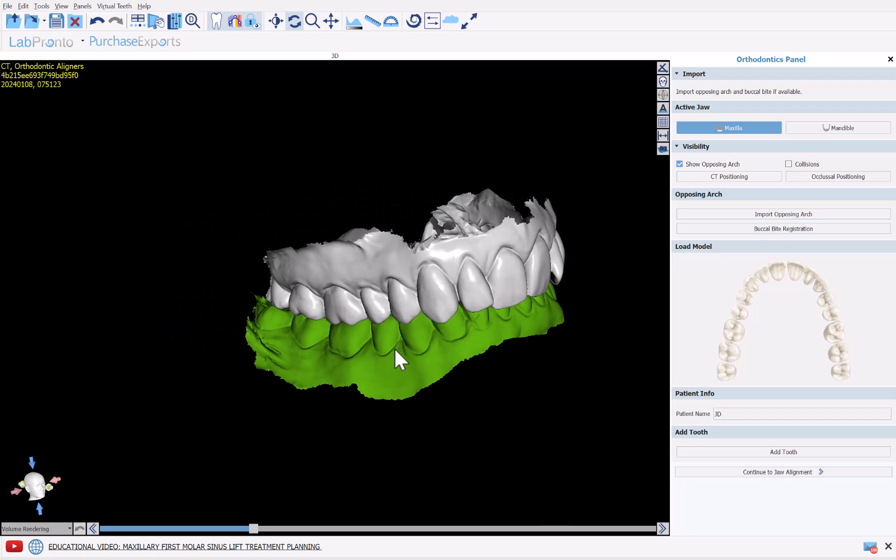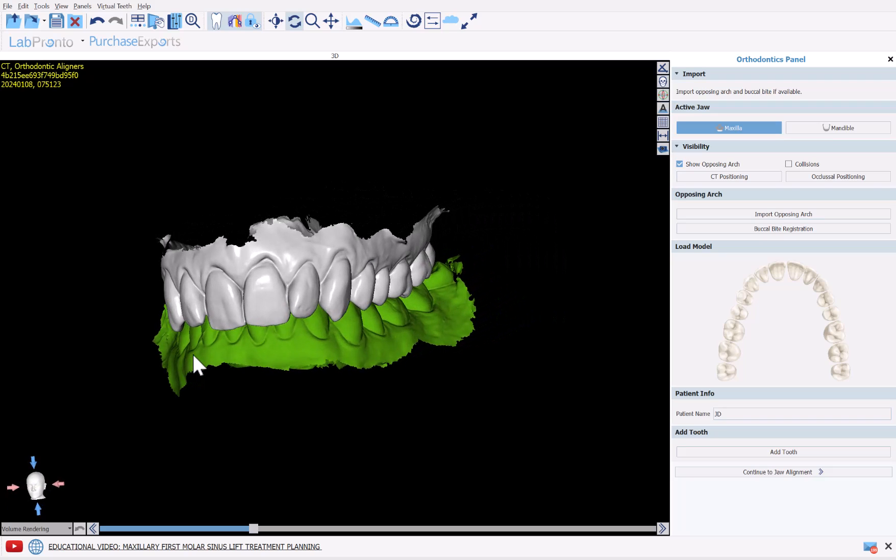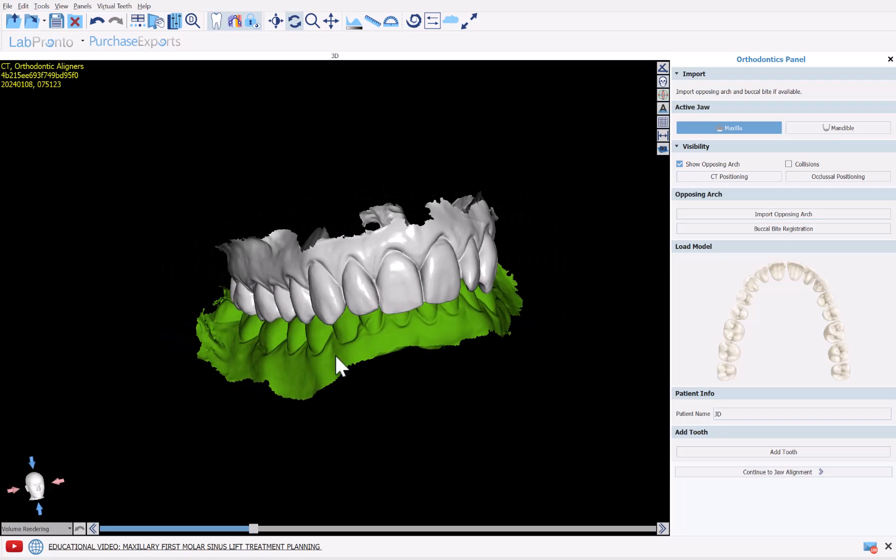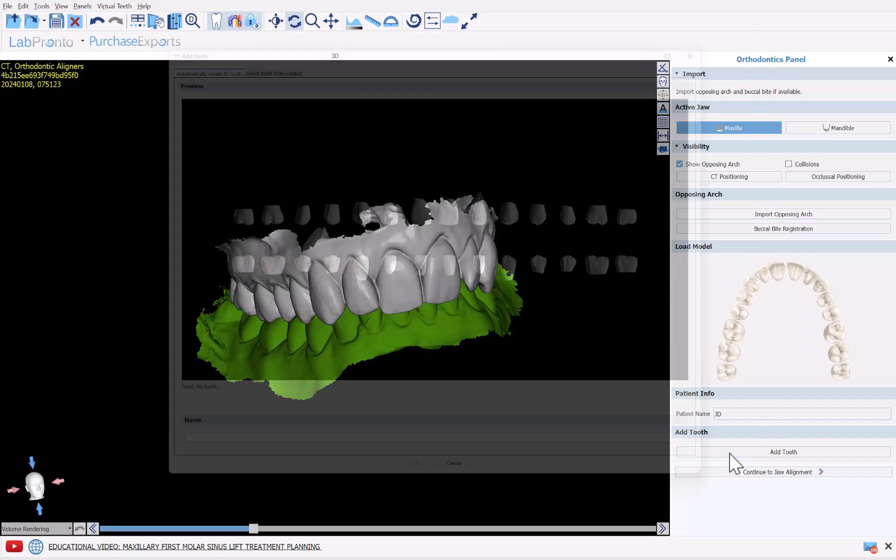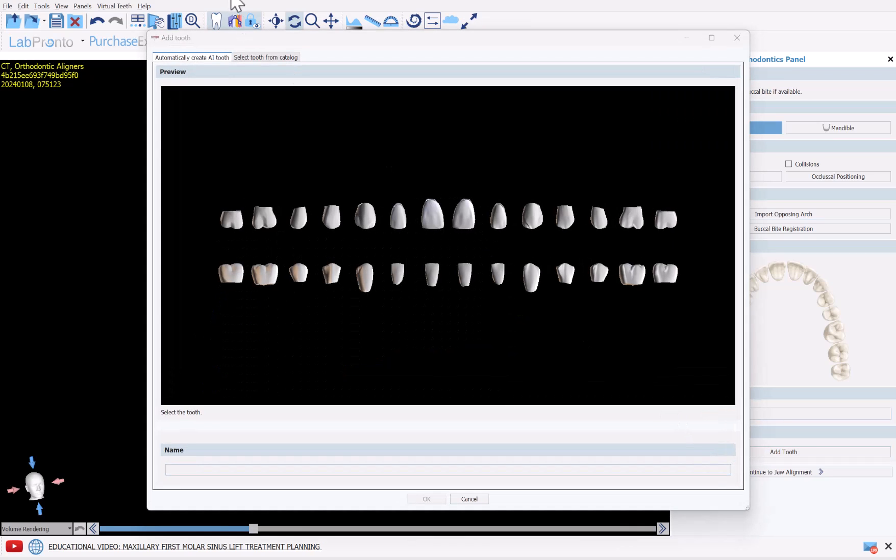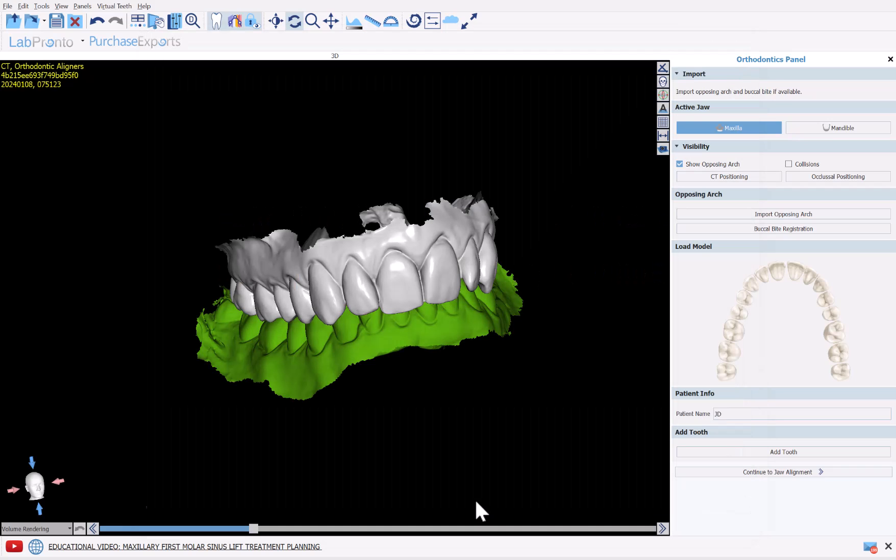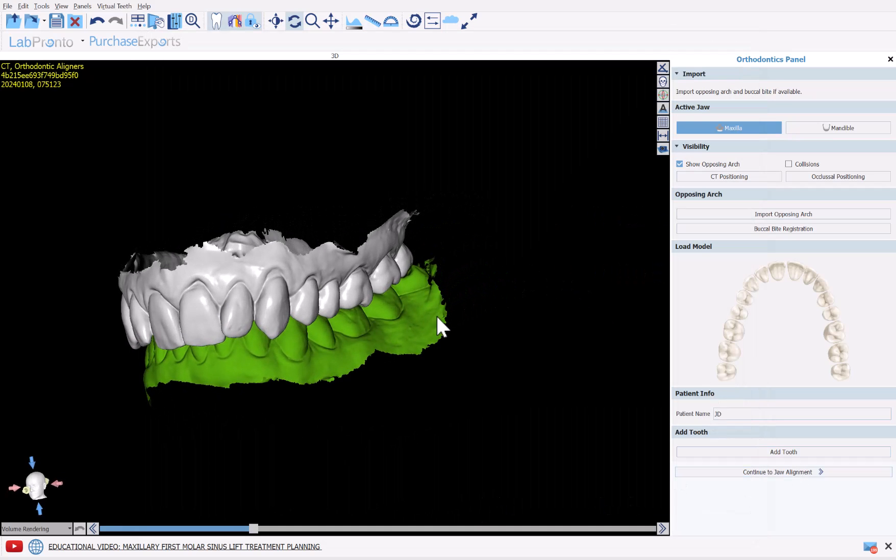What we also have here is the option to add a tooth. So in our situation, we don't need to add a tooth. All the relevant teeth are here. I'll just demonstrate and I'll click Add Tooth and I'll show that we've introduced a new option in BlueSky Plan now to automatically create an AI tooth for your particular case. If you were adding a tooth here, you're simply going to select the relevant tooth. You'll click the OK button and then you'll click the relevant spot in the model and you'll have a tooth generated based on your particular data set and your particular optical scans and the tooth will be added to your model.